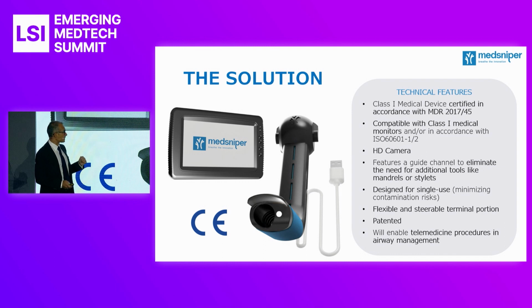Okay, it's obviously single use, and it has a guiding channel. Usually there is a stylet that you use, and with this device you do not need it.